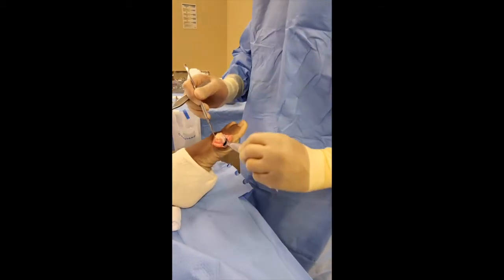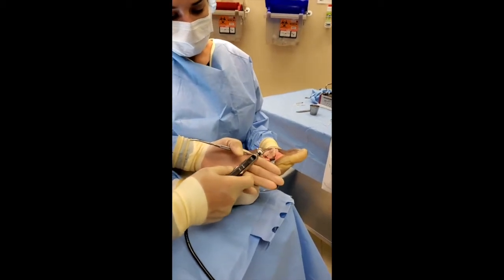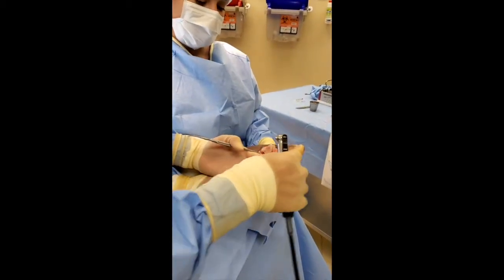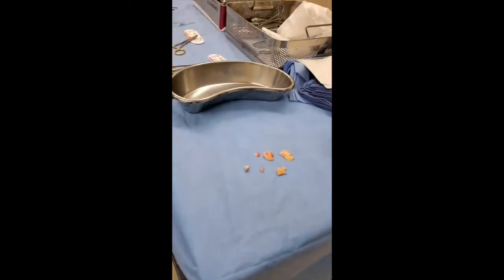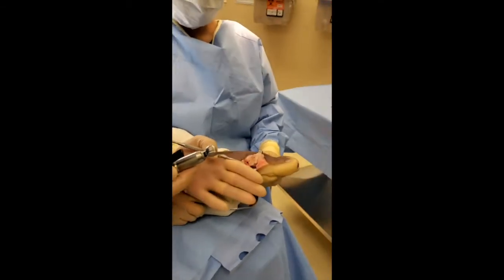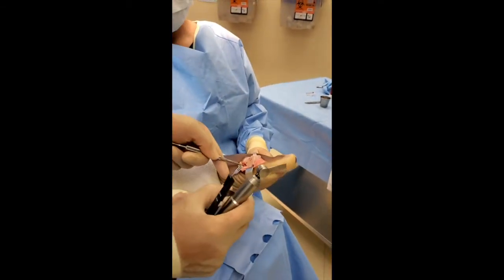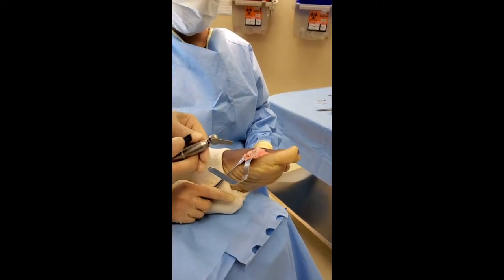Now we've cleaned up all the bone — shaved bone off the top and off the opposite side. Why don't we go to the table and show how much bone was already removed just to do that portion. Now we're going to cut a wedge of bone out of this foot, shorten it and lower it, so it gives him a better range of motion.